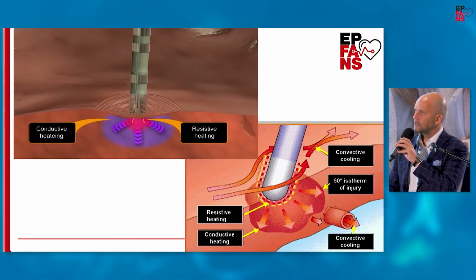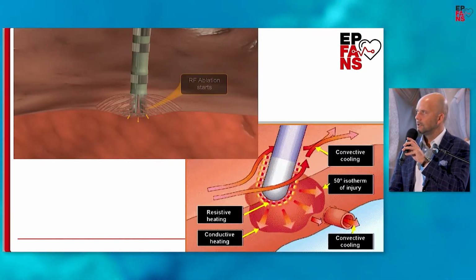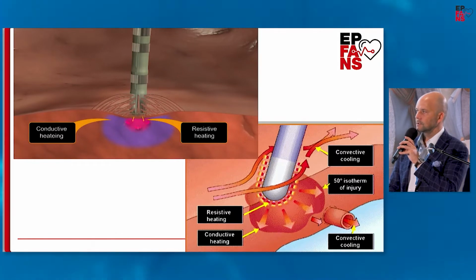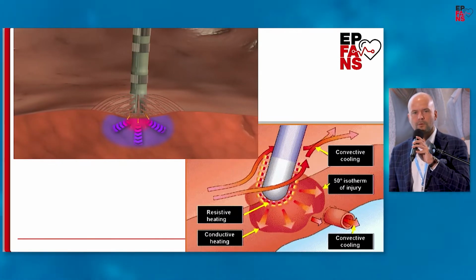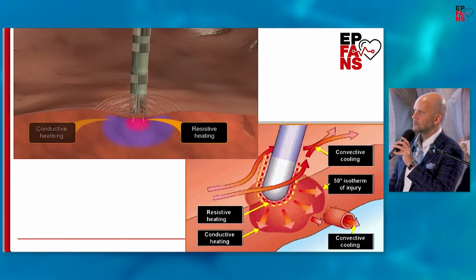In other case, if you want to stop the energy delivery, the thermal latency may lead to complete AV block. This nicely explains the reason why you need one more person in front of the screen of EP system, because you both are responsible for this observation.